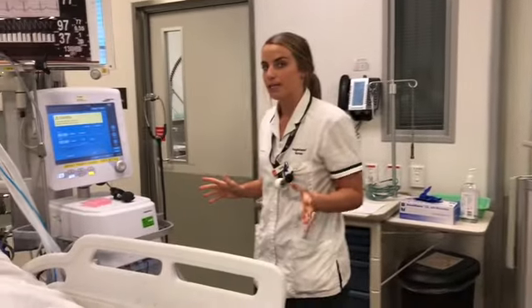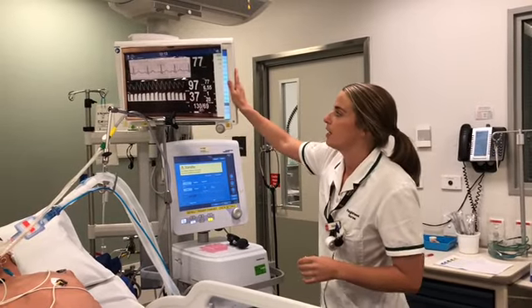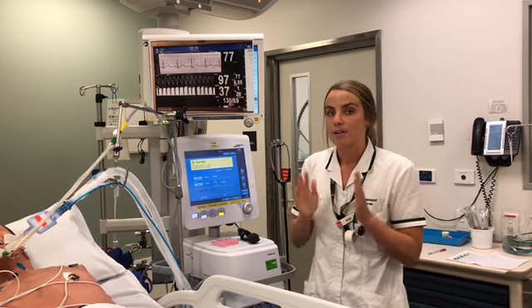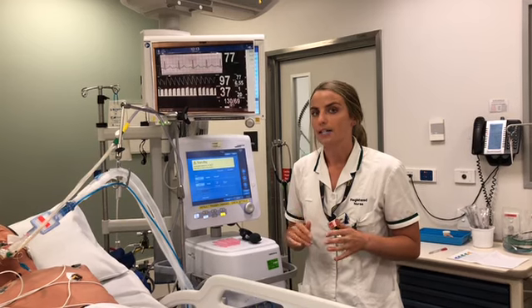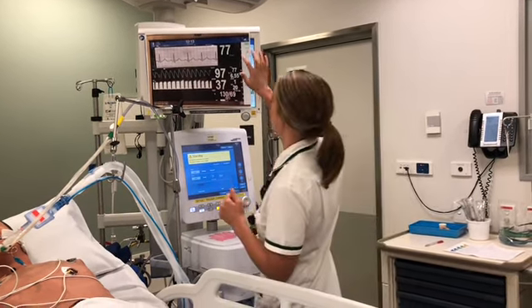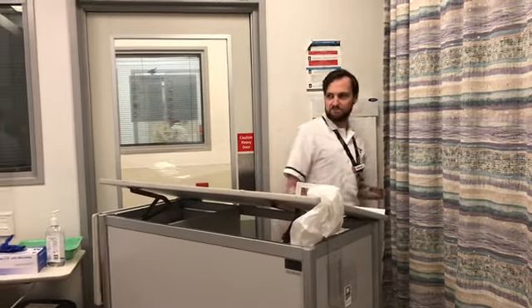Alright, moving back to the bed space, we're moving on to our monitors and our ventilator. Checking our alarm limits, we want these parameters set very tightly. You'll be stepping away from the bed space, so you want to make sure that you're notified if anything goes outside of the limits that you're happy with. While Kate's doing that, I will step away and I will gather these equipments.